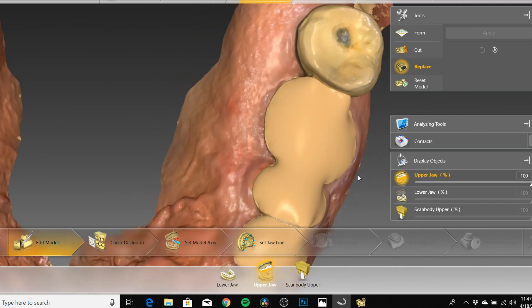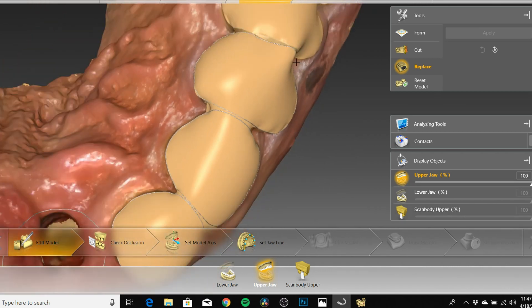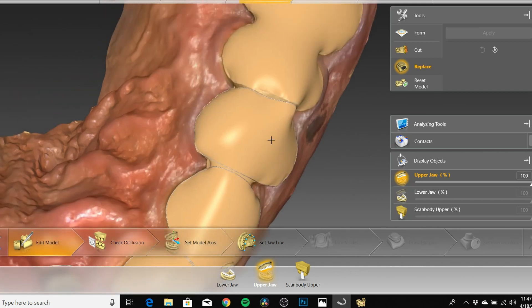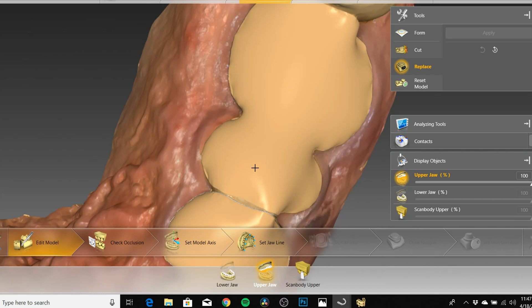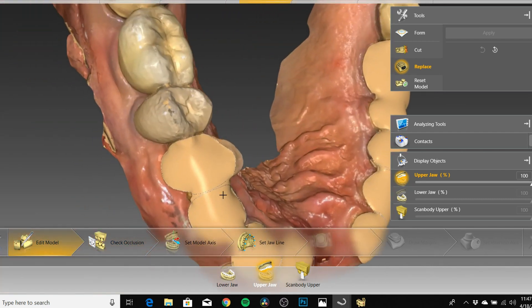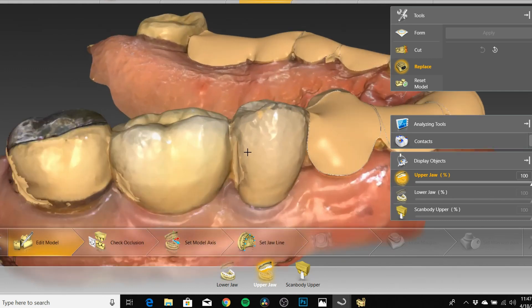Then you would just go in and mark your margins around this area. One thing to know when marking these margins: you don't want them to intersect. The only way you can tell is once you get to Set Insertion Axis — if any of the margins are intersecting, you won't be able to virtually seat the crowns to print your models. So just keep that in mind. You want to ensure that the mesial margin of one tooth isn't intersecting with the distal margin of the adjacent tooth.